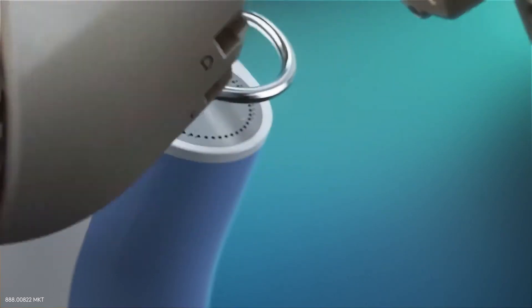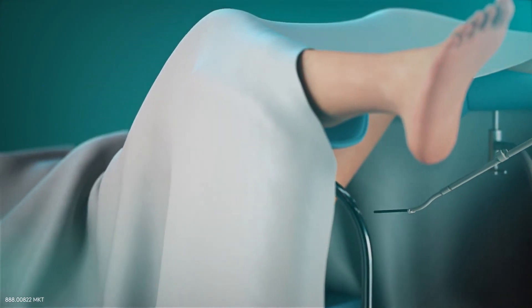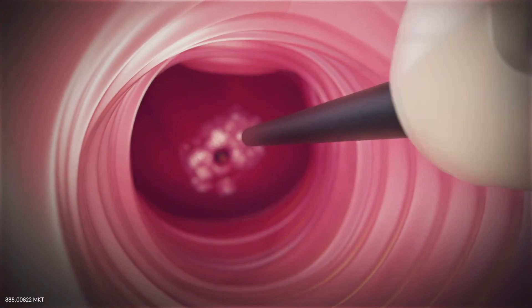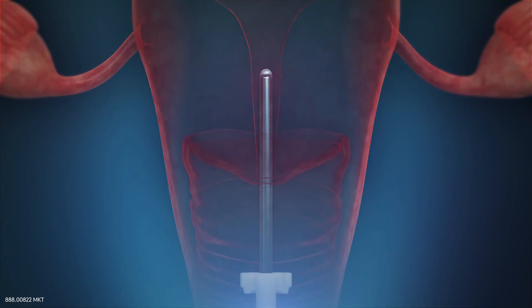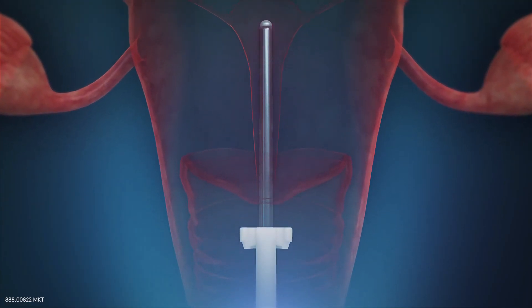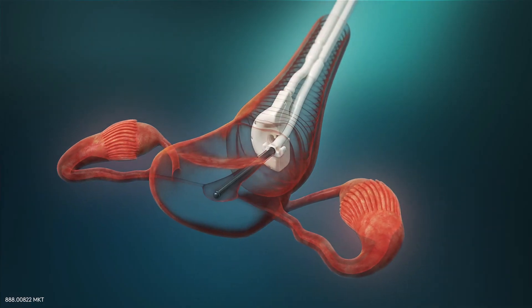Permanent. Radioactive implants emit radiation 24-7 until there's no radiation left in them. The implants or seeds, which are about the size of a grain of rice, remain in your body. This treatment is also called seed implantation.